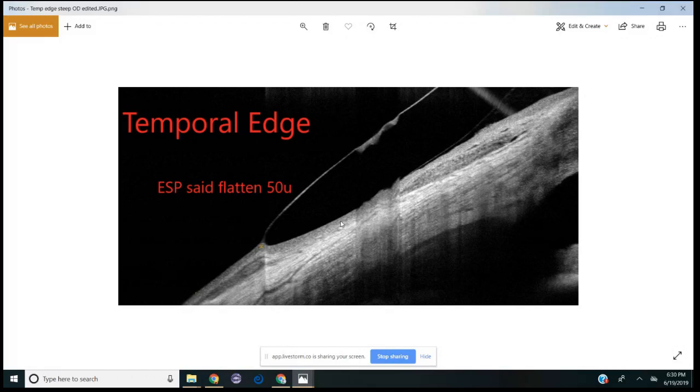We've been fitting sclerals for a long time without scleral profilometry or topography, and we do it, but it's a trial and error process. You grab the first sagittal height lens in your fit set. I think a lot of people grab a 4400 just to start with, but we're trial and error, you know, back then, and now we don't have to be. I kind of think of it like, if you're going to refract someone, are you going to refract them with plus or minus 2 just to see what they are? Are you just going to trial and error it? Or would you rather take a measurement and then refine that measurement? So that's how I see this working.